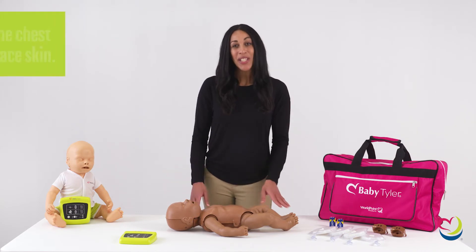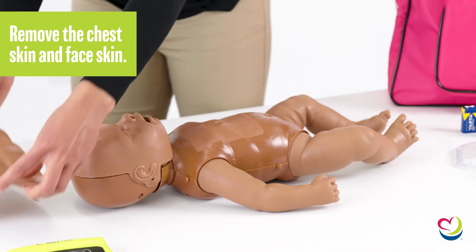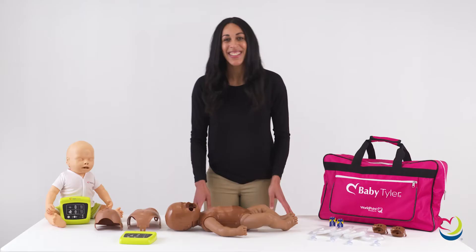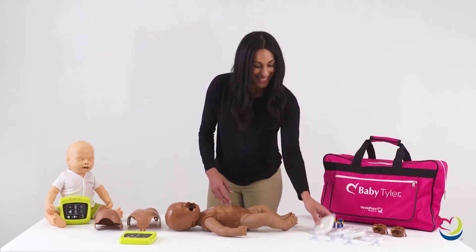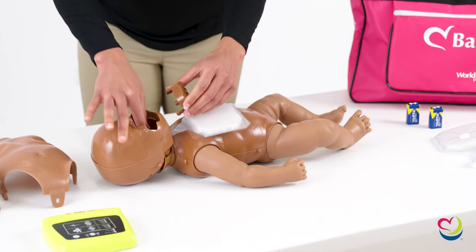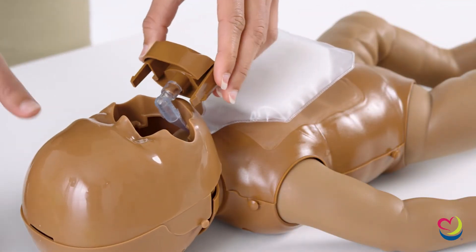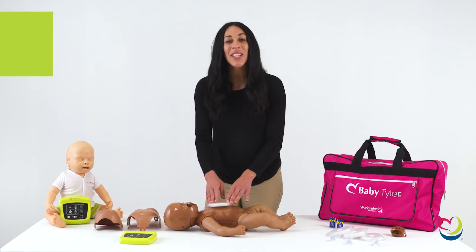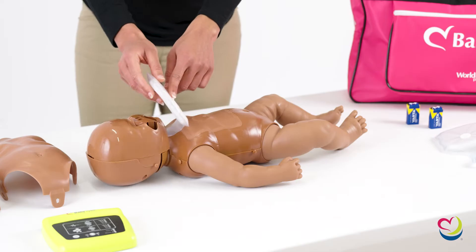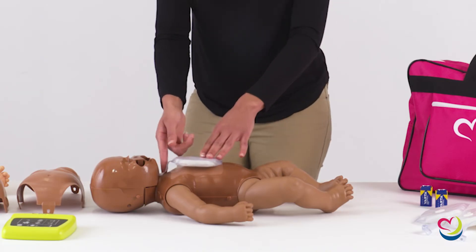Assembling Baby Tyler is easy. First, remove the chest skin and the face skin. Next, move the lung below the jaw and connect the mouthpiece to the lung, and make sure the mouthpiece is correctly attached to the head. Place the lung on the chest and make sure the lung bag lines up with the bottom line of the chest square. Attach the lung bag to the chest using the sticker on the lung bag. Make sure the lung rests loosely on the neck.